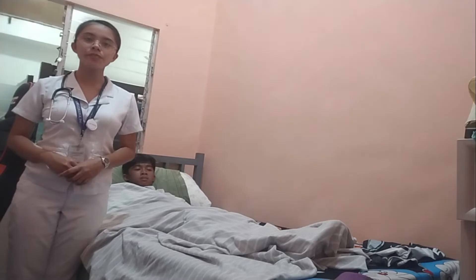Good day everyone! My name is Jasmin Medas-Dania from BSN 111B and today I will be performing a return demonstration of the cardiovascular system assessment.